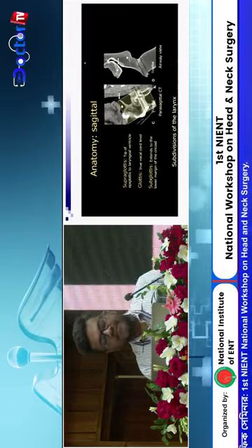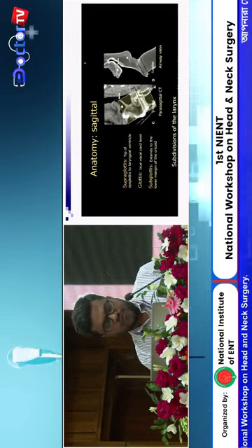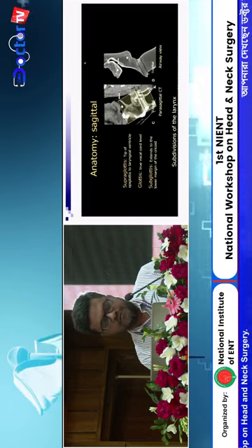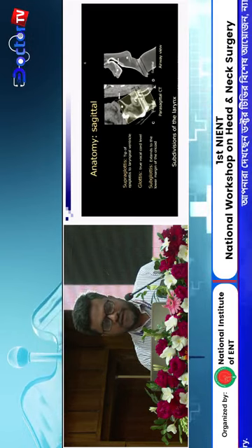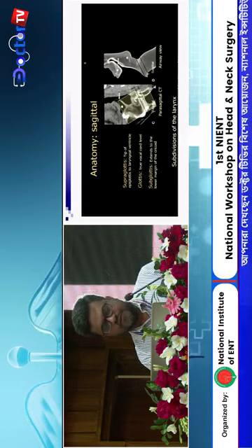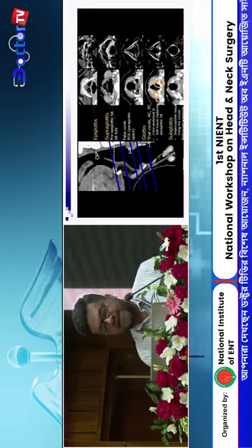And the same image, sagittal view. Here we identify the hyoid bone and draw a line perpendicular to the horizontal part of the hyoid bone. This is the supraglottis, and the true vocal fold area is glottis, and below is subglottis. And now we go for axial images.